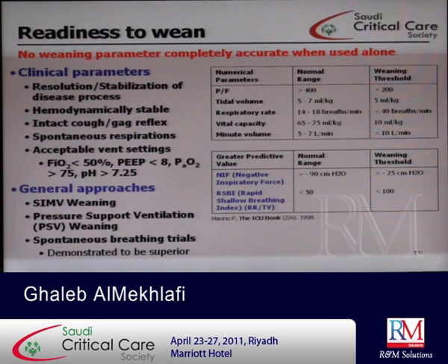And we can do these 2 tests on the ventilator itself. Usually it's done by the RT. These are the NIF, or negative inspiratory force, and the RSBI, or rapid shallow breathing index. The rapid shallow breathing index is the respiratory rate divided by tidal volume in liters. So if the patient has a NIF more than -25 or a rapid shallow breathing index less than 100, then the patient may be ready to wean.